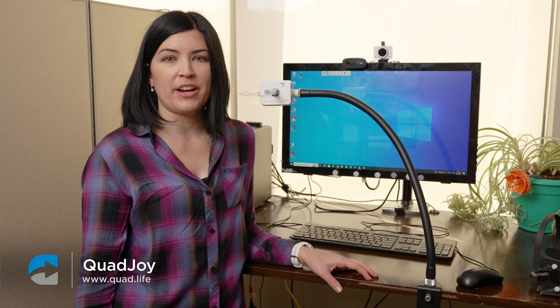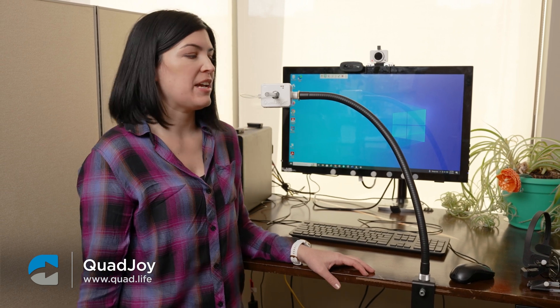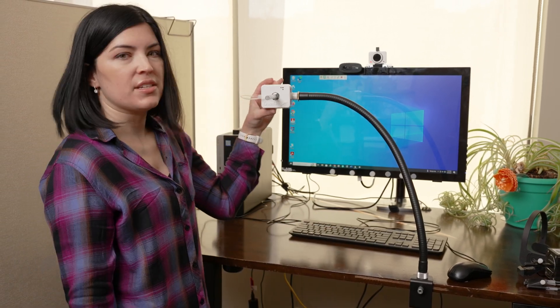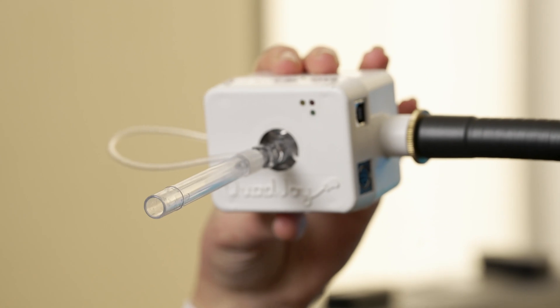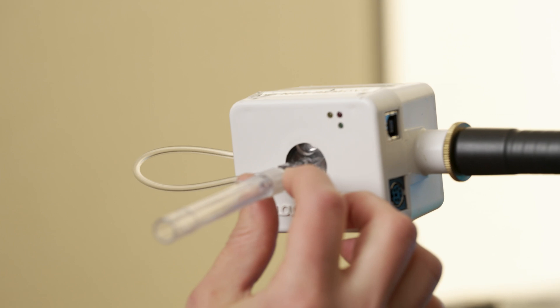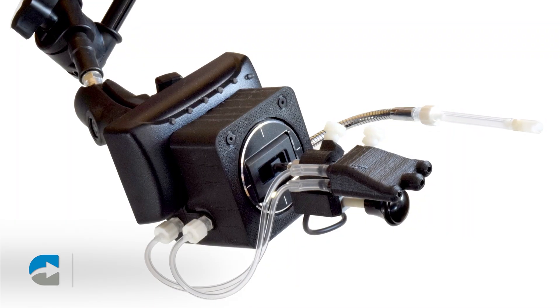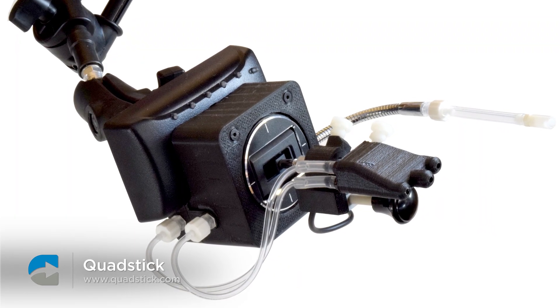If a head control mouse isn't right for you, you could also use a mouth controlled mouse. There are also a lot of different options for these kind of mice. This is one of them — this is a Quad Joy. With this one, this part is a joystick, so you would put your mouth on the straw here to move the cursor as a joystick, and then with the straw, you would either sip or puff in it to click.